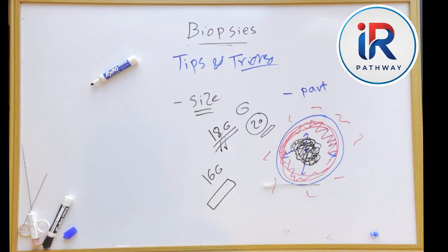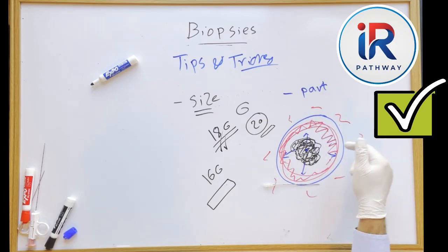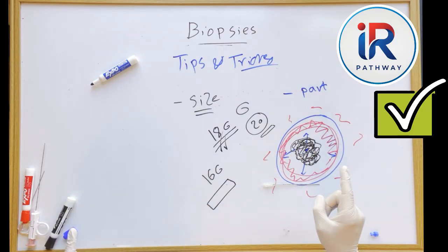That's why it's very important before performing any biopsy to review the previous imaging. From these images, you can identify the best site for sampling, determine the optimal approach, estimate the depth, and decide the appropriate needle length you need.